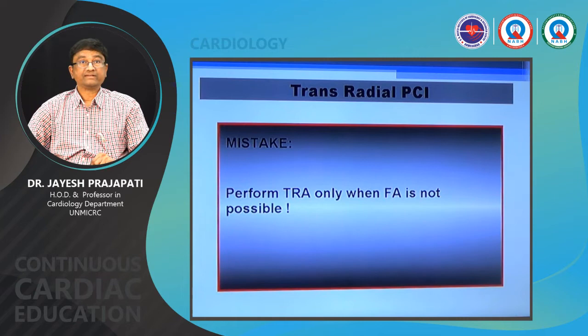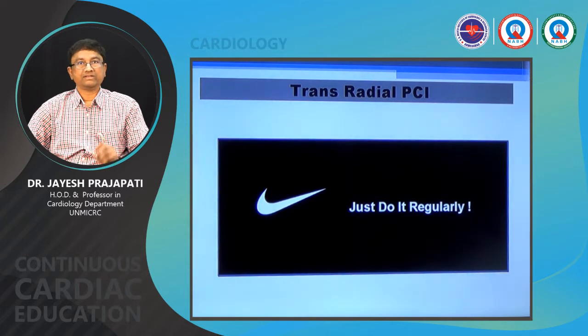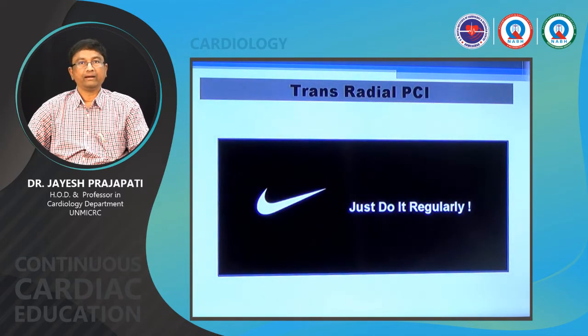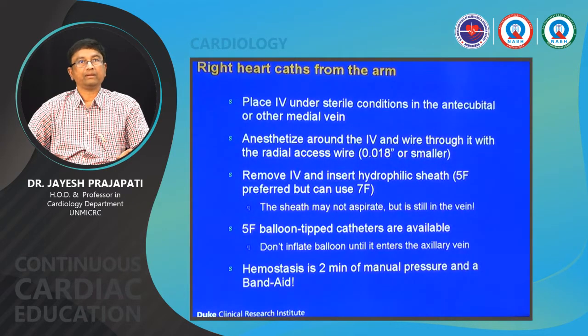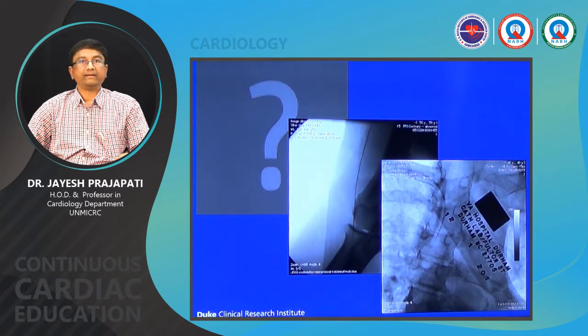Some people say that transradial is to be done when the femoral is not possible, but nowadays it is a reverse thing. So we should always keep motivation. Nowadays in India, almost most of the centers are doing with a radial route. We just have to do it regularly, and then we will be masters of this technique.